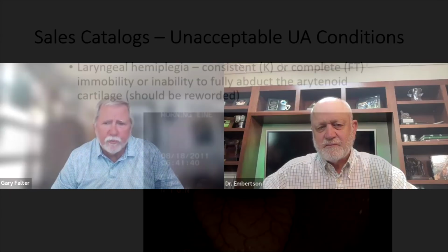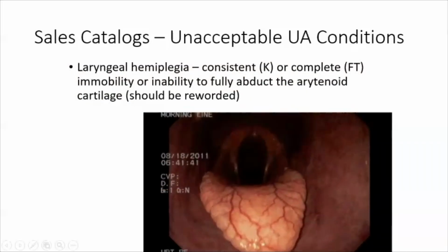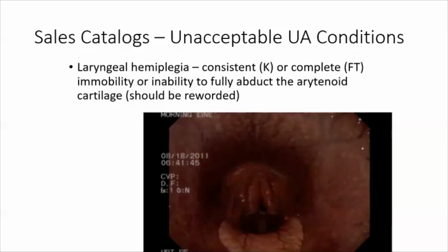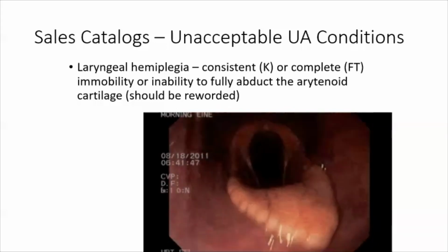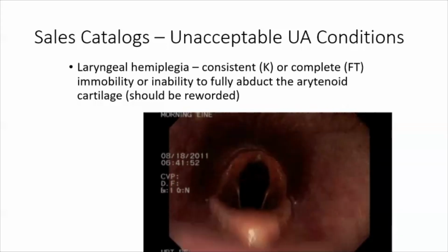Okay. So before we watch the video of the surgery, you have some slides that we can review, and it helps explain many of these throat conditions, and especially as it relates to sale horses. So why don't we go ahead and go through some of these slides real quick? Okay, so the first thing, we have a few slides here that are listed in the catalog. They're unacceptable. So if you see this in a sale horse, that horse does not pass conditions of sale. And that's why we scope the horses at the sale.